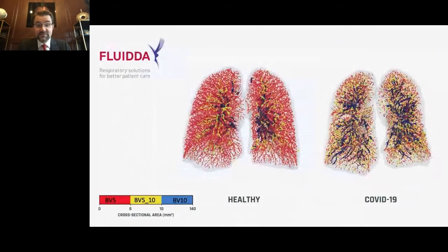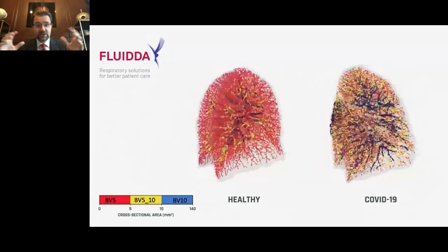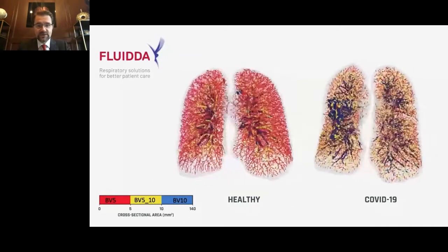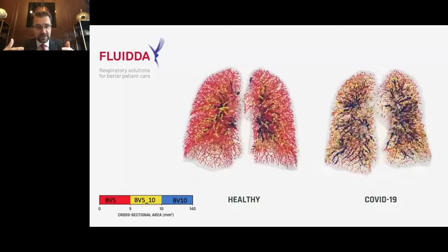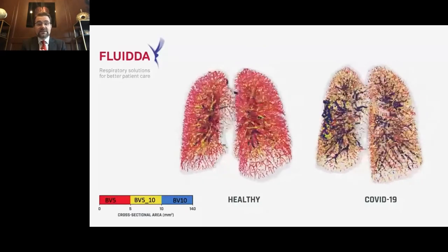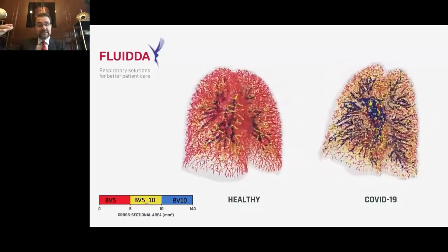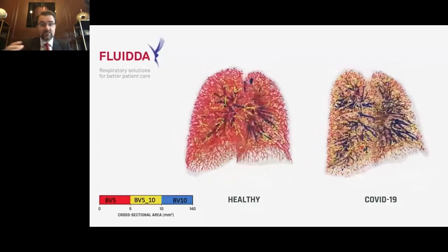You can also see this visually. On the left-hand side, again, a healthy control. You see a lot of these red zones. On the right-hand side, acute COVID-19, you see a lot of these red zones disappear. So it's not that the blood vessels disappear, but we believe, likely due to endothelial damage caused by the virus, you have microvascular occlusion leading to upstream dilation. So you don't see a lot of smaller vessels because they become dilated because of downstream obstruction. The upstream dilation makes them larger.